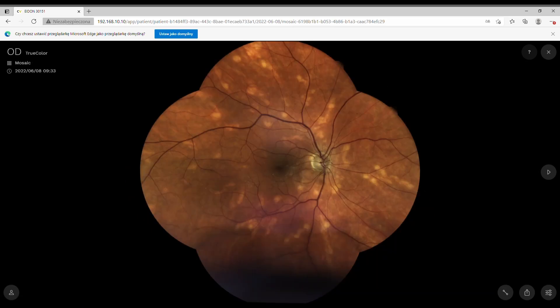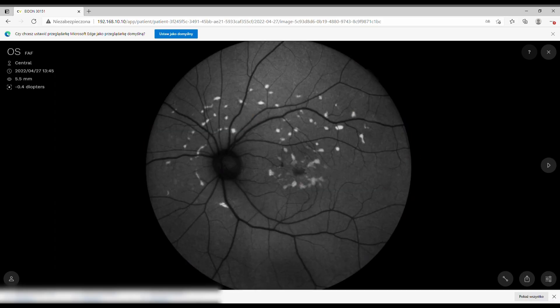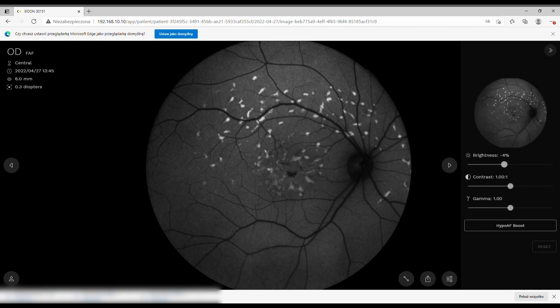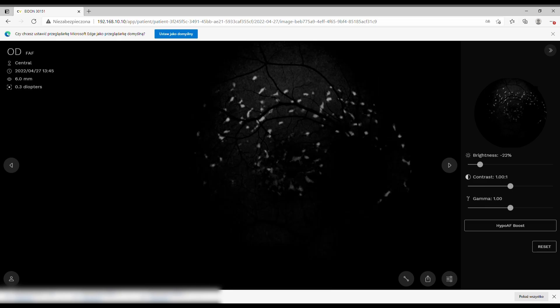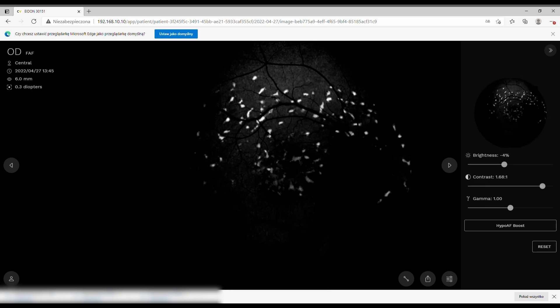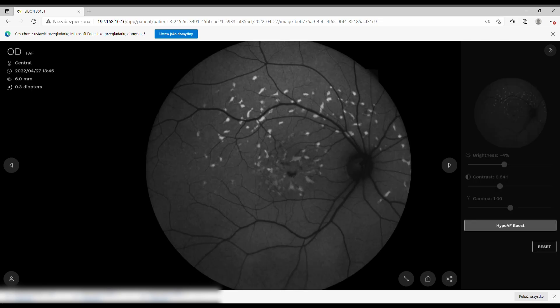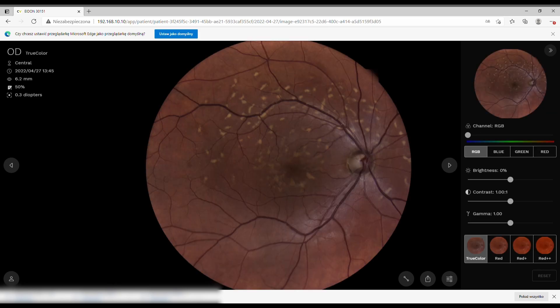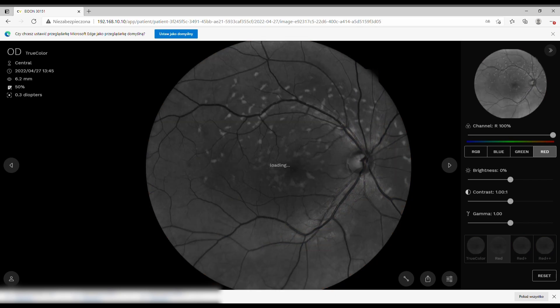Without the ultra-wide field lens, the mosaic previously required four shots for what is now a single shot. Autofluorescence looks stunning. Without the lens you can still change many factors — brightness, contrast, gamma — and there is a hypo-autofluorescent boost that gives very sharp images. All the filters, including Red Plus Plus and the caliper option, remain available.